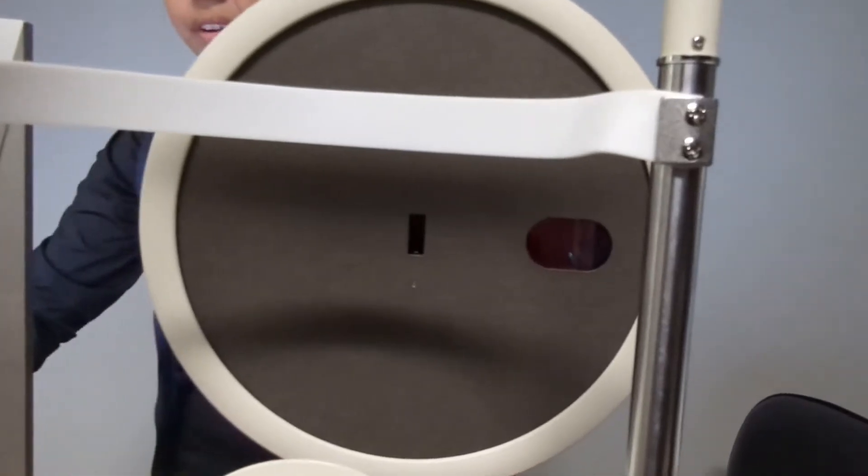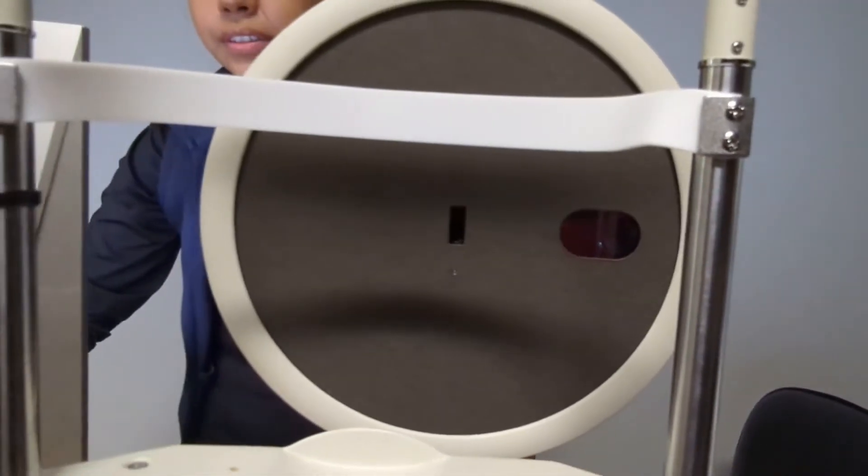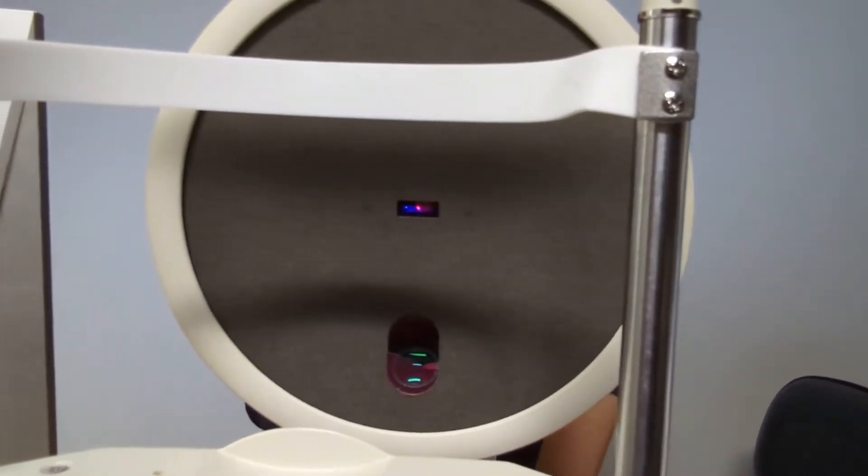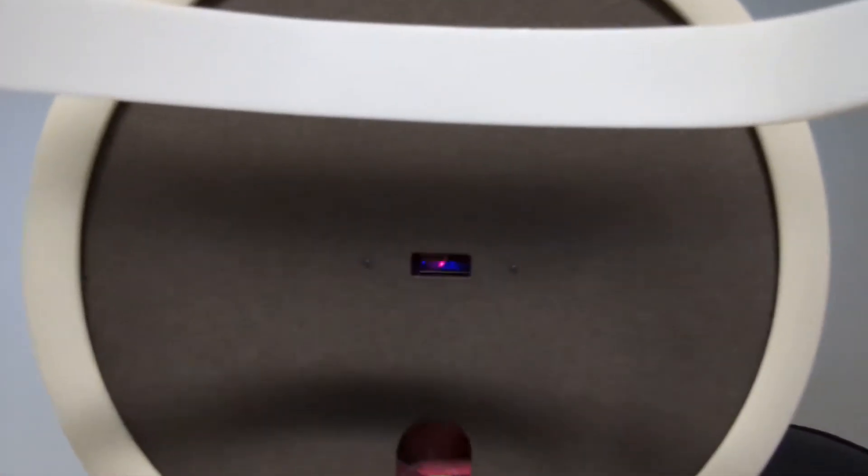Let me go ahead and start this machine. Go ahead and place your chin on the chin rest and forehead against the bar. Don't move — hold it, hold it, hold it.